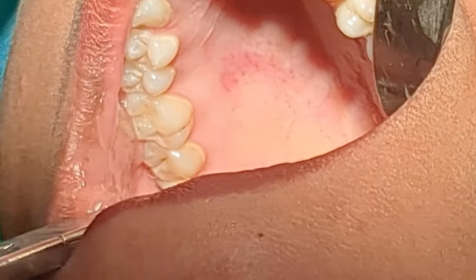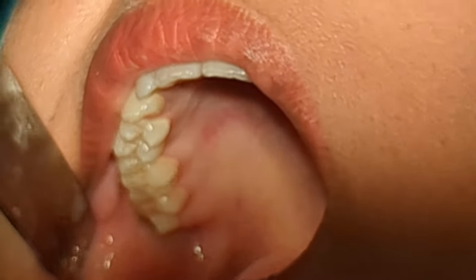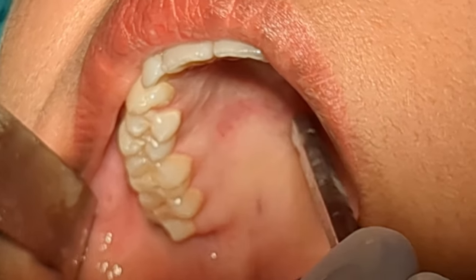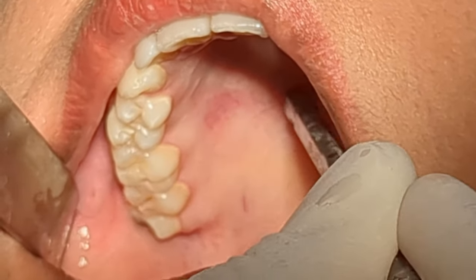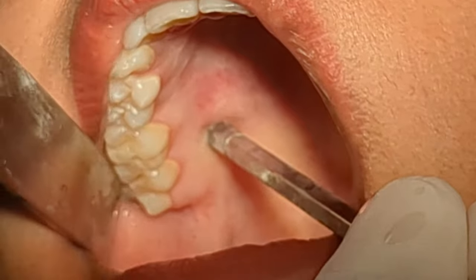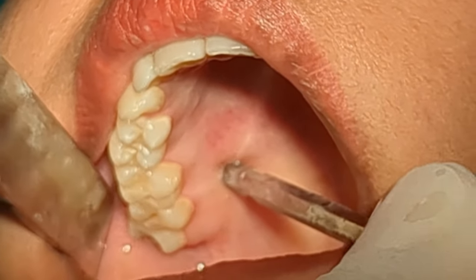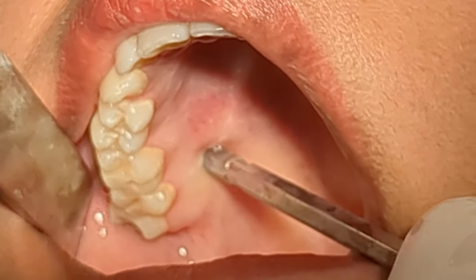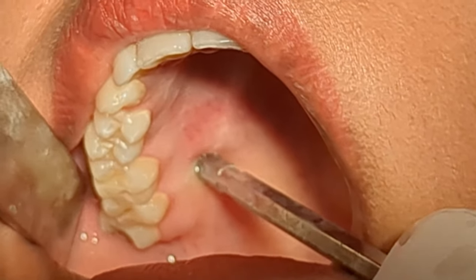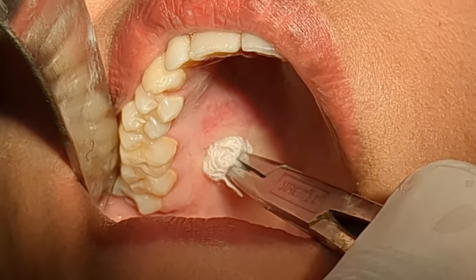For a proper greater palatine nerve block, you need to locate the greater palatine foramen using the back of the mouth mirror. At the junction of the alveolar process and the palatine bone, you palpate and go back — you will feel a depression. This depression is usually between the second and third molar. I can feel the depression of the greater palatine foramen here. The foramen is located at the junction of the alveolar bone and palatine bone. I am going to apply the topical anesthetic soaked gauze at the greater palatine foramen.